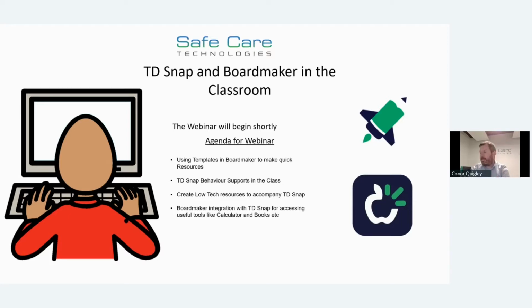So today, this webinar is a new topic for us. It's a question we're getting asked a lot lately. Obviously we supply TD Snap and we also supply Boardmaker, but is there any way that the two can work together, and in what instances have we seen it work well together in school? So this webinar is just to give some ideas and some of the resources that are available, and how TD Snap and Boardmaker do work together, where the similarities are, and where you can use them in different applications and scenarios, primarily for schools and for classrooms. So without further ado, let's get started.